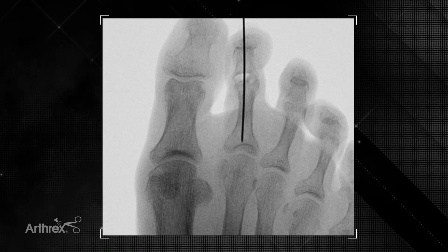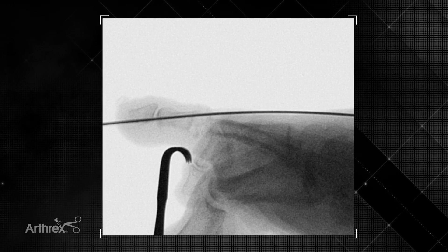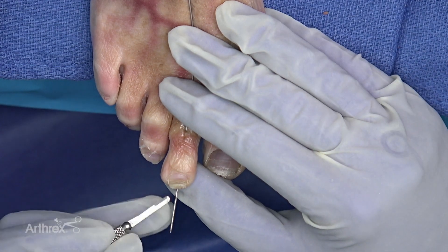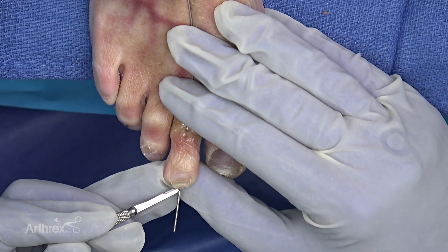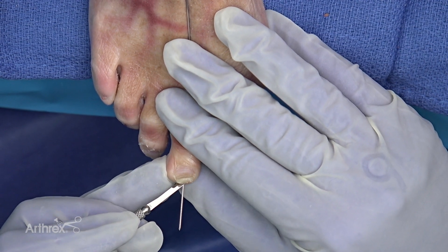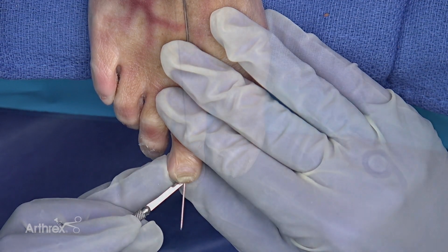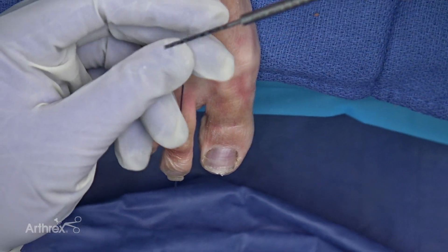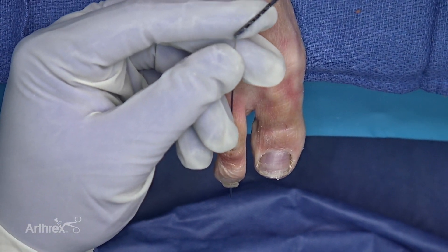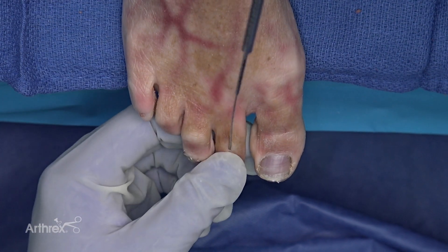On the AP plane the position is great, particularly with regards to the middle phalanx. On the lateral plane we can see we're completely lined up appropriately within the middle phalanx. Using the beaver blade I'm going to cut an incision for exit of the drill bit and insertion of the screw at the tip of the distal phalanx around the exit point for the guide wire. Now we're going to drill antegrade through the middle phalanx and out the distal phalanx using the 2 millimeter cannulated drill.